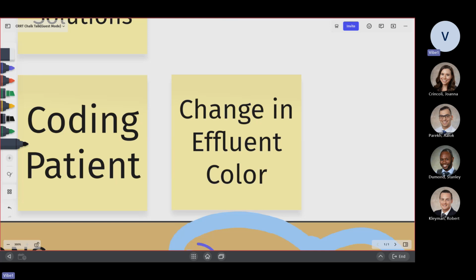And on our end, if you're concerned and you don't want to change the filter, if you're questioning whether the fluid is just a little bit orange or a little bit pink, no, you cannot.